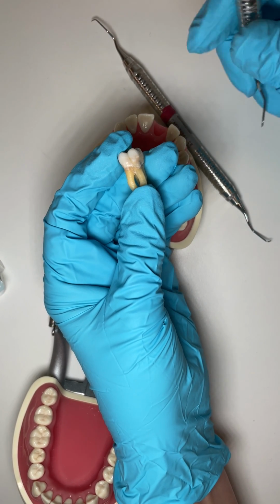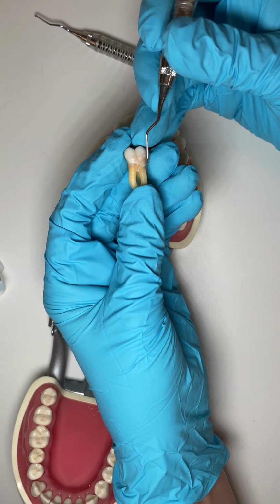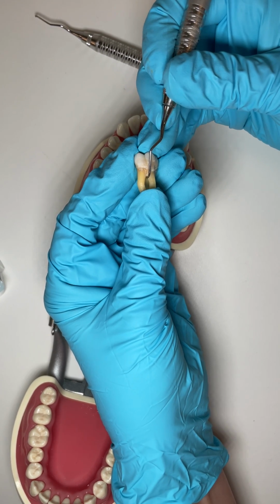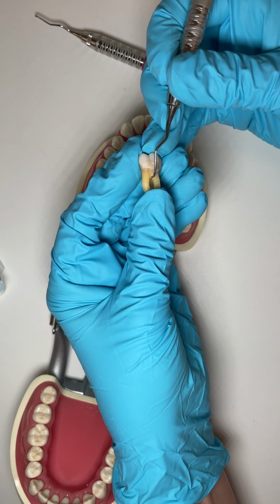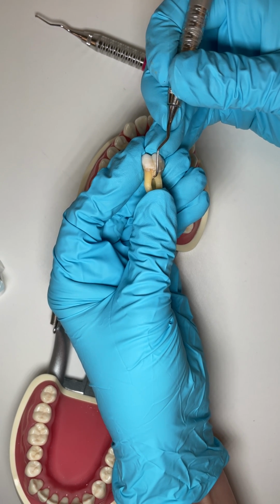And then if I wanted to clean the distal of the mesial root, I would use my 13-14 because I'm cleaning the distal, even though it is a mesial root. I would use that 13-14 instrument down in there to clean that area.